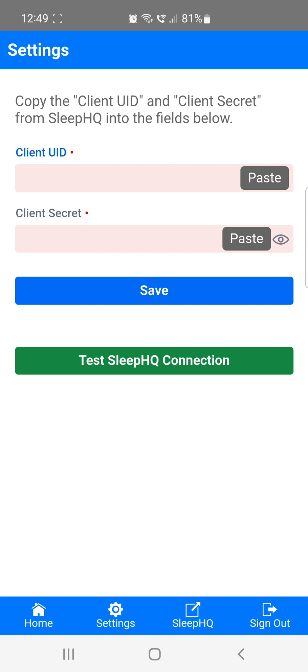Here, you'll need to enter your API client ID and client secret from Sleep HQ. This step is super important as it lets the Sleep Data app communicate with your Sleep HQ account.